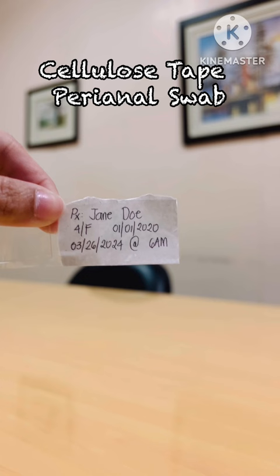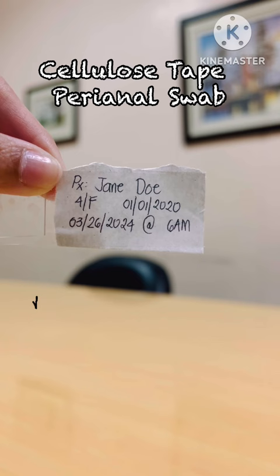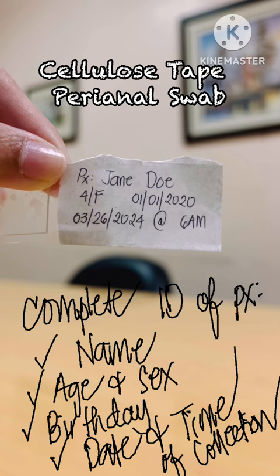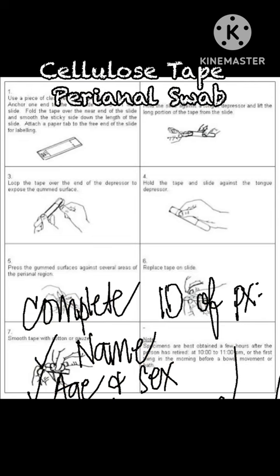Just a brief reminder: it is very important to provide complete patient identification on the label. This means writing the complete name of the patient, their age and sex, and date of birth. Also important is the date and time of collection. Please do not forget this — this is how to properly label the cellulose tape perianal swab.